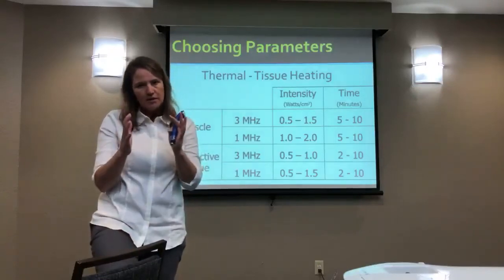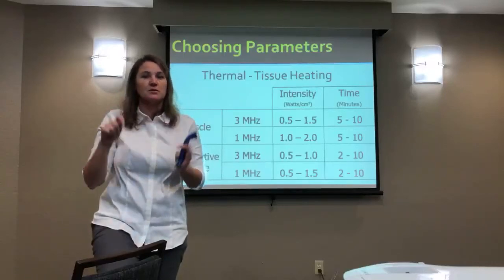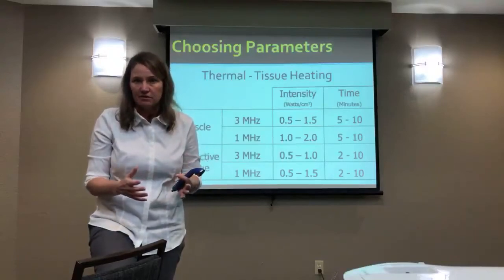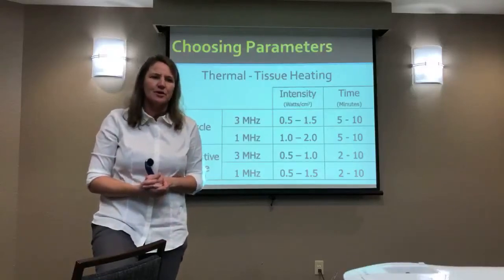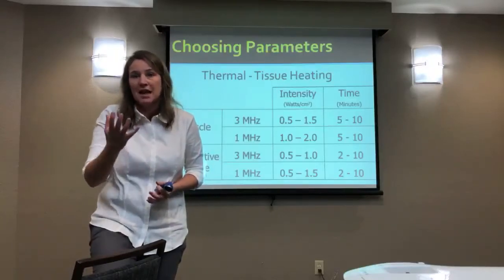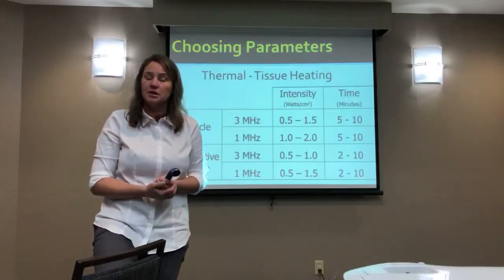So these are ranges I put in there to say that at the upper range, if you're using 2 to 3 times the size of your sound head, they're probably going to experience and encounter some discomfort, and you're going to have to make some adjustments. If you're at the lower end of the range, it's more conservative. So first of all, I don't want anyone to experience discomfort, but if this is someone I want to do the treatment on, I think it'll be effective, but I'm a little bit concerned about their ability to respond to me, or that they're going to tell me, if I want to be conservative, I'll go with something towards the lower end. And I'm going to treat conservatively, and I'm going to realize my outcomes are not going to be as likely or as remarkable. Not that any outcome is remarkable, you know what I mean? I would just err to the side of caution in those cases.